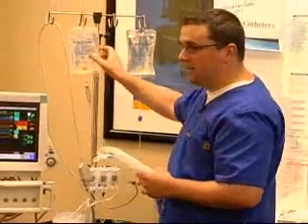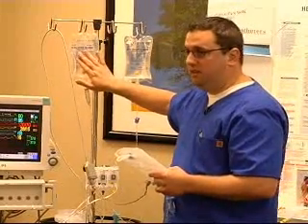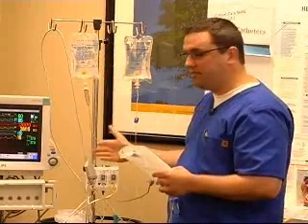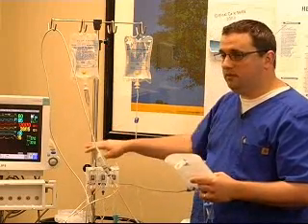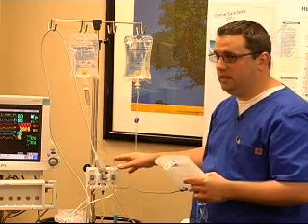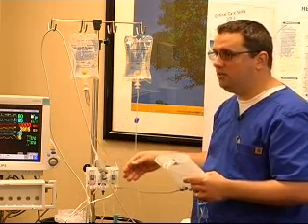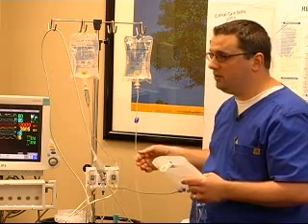One of the things we tend to forget, and I don't have a label with me, but making sure that we put a label on here, okay? Now, we also have a trifurcated set. So just rapid math here. We've got these that run at 3 cc's an hour, right? We've got 3 lines, and most likely you're going to run pretty close to being over half of your bag before a 24-hour time period's up.